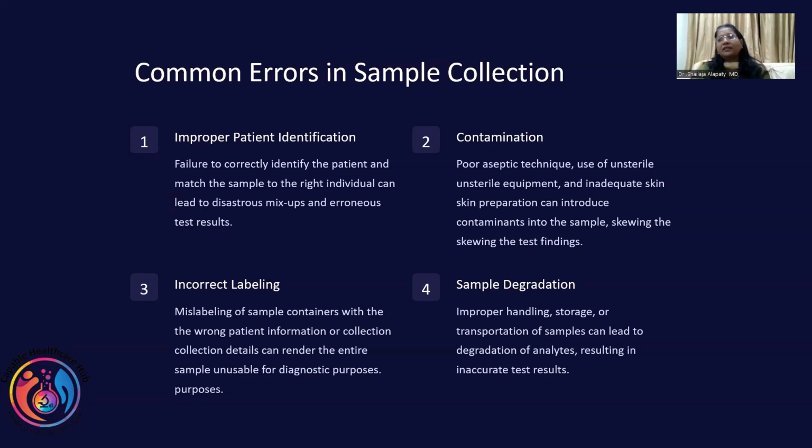It will deteriorate. More than 4 hours, CBC will deteriorate, all the cells will deteriorate. These are very, very common, and we think that the person who's doing it is doing it properly, until the clinician calls and says something is wrong. They are not correlating. No. How do we stop it?